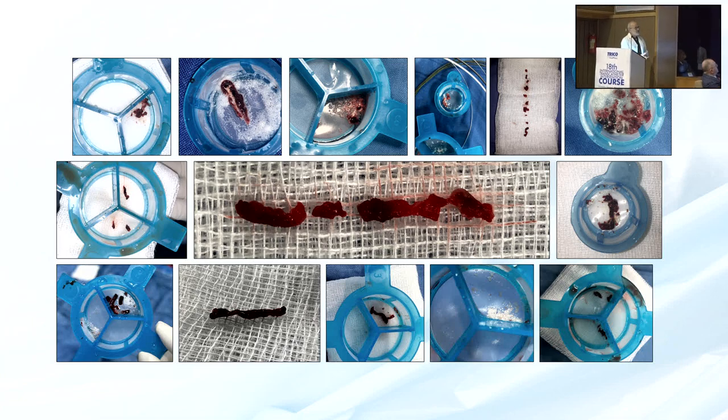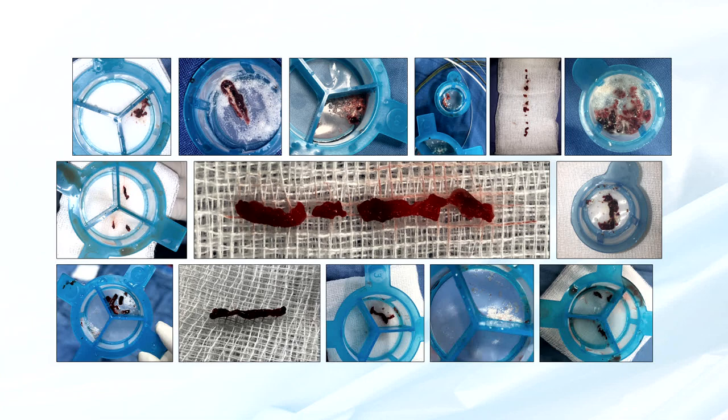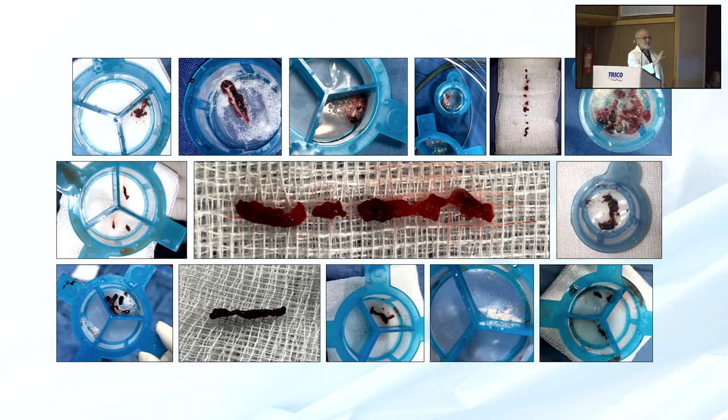I am quite particular about assessing the ostium when I am deep intubating in the left, because if you dissect the circ ostium, you can expect a dissection extending in the left main, going right in the aorta up to the innominate. So I am very careful. The other complication, of course, is pulling thrombus back from the circumflex and it ends up going down to the LAD or vice versa. It has happened during COVID time, a couple of times, maybe 3-4 times. But it was not a very difficult thing to handle at that point of time. It was a little bit up there going distally, which we tried to dilate or push deep inside, just to make sure that the major part of the artery and the branches are flowing well.